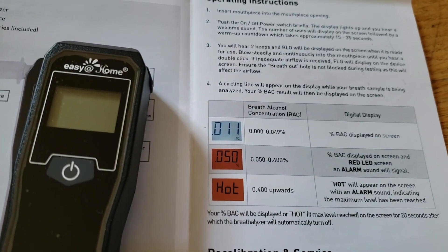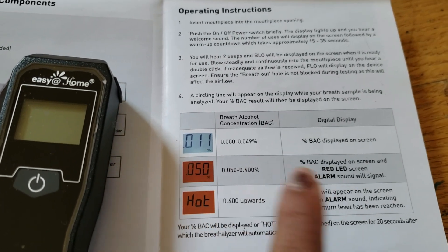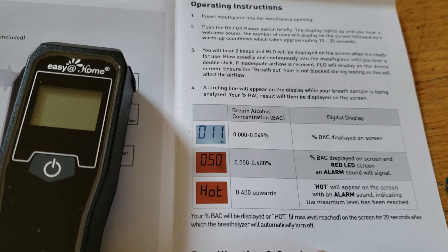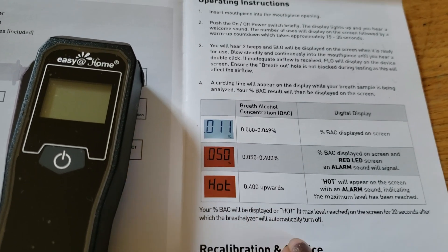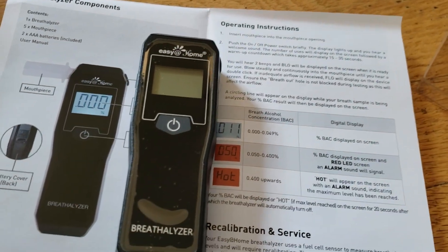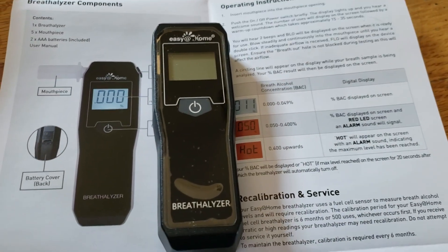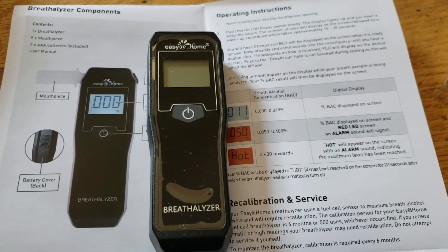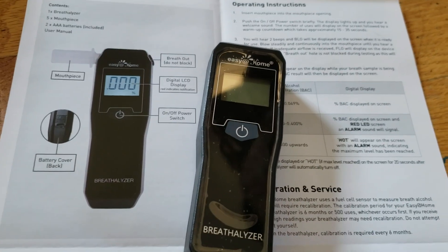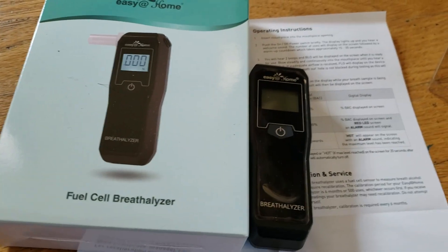This is what it tells you about the breath alcohol concentration — BAC. A reading of 0.4 upwards indicates the maximum level has been reached. This is really good to have on hand if you know someone who has had a problem with drinking and driving. It's a really good product, and it came very well packed in the package with everything in it.